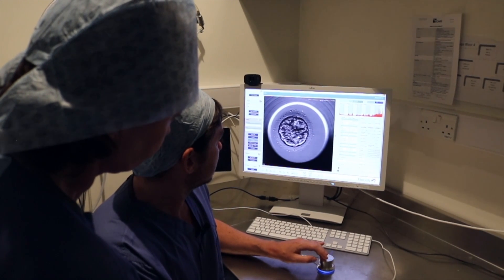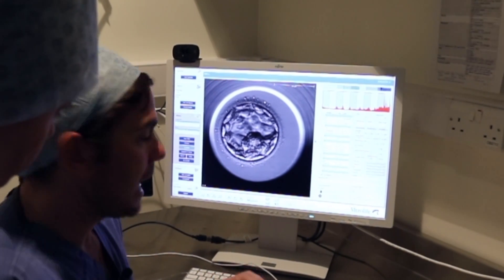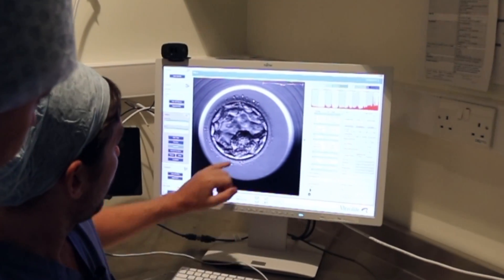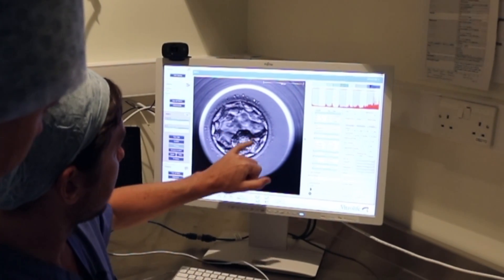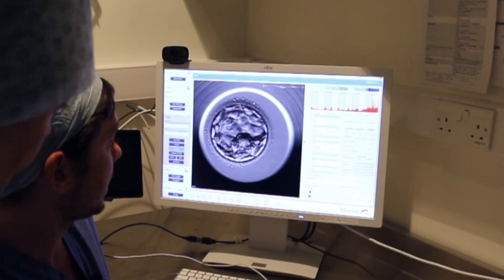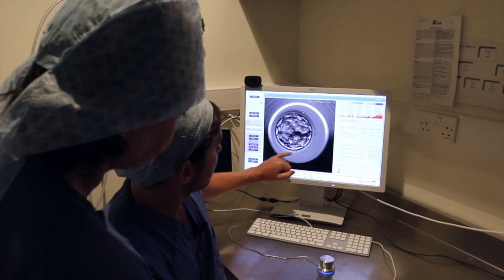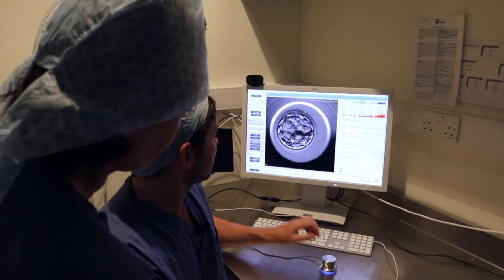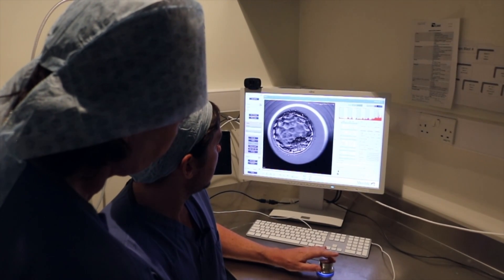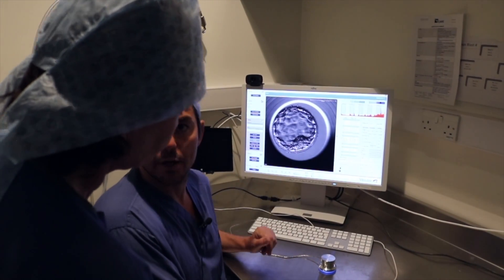It will start expanding as it's doing that and it will grow and grow and grow. Now what we can see is the first stages of the cells starting to differentiate. We have this big group of cells developing here which is called the inner cell mass — this is where the baby is going to come from if this embryo implants successfully. The rest of the cells around here will support the rest of the pregnancy, forming the placenta and the sac which the baby will develop in. We carry on letting it develop until it's right at that stage, and now it's ready to go back into mum.